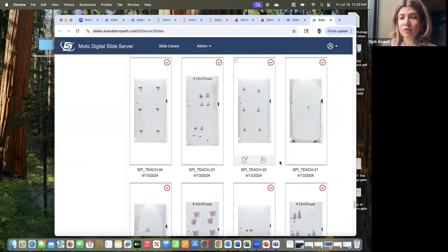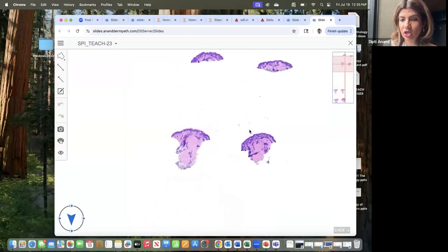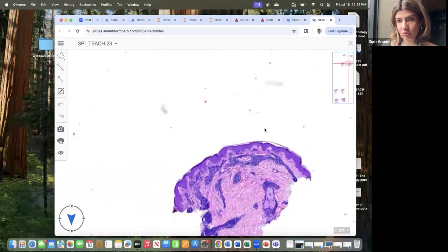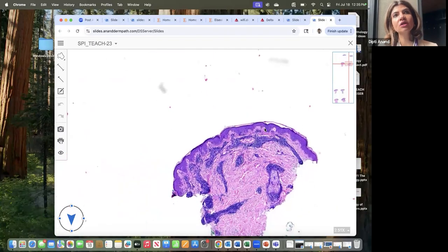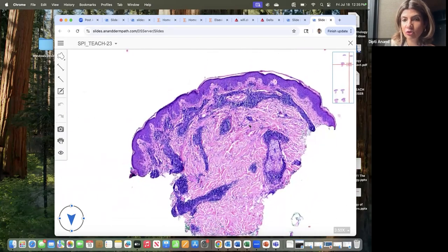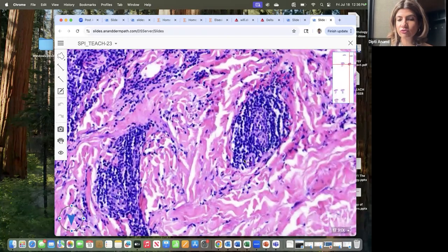The other thing is pernio and polymorphous light eruption will both look the same. Pernio is the cold phenomenon, PMLE is the hot phenomenon. Polymorphous light eruption will look like pernio, plus because it is light, it can also look like other things. But this is how you approach this biopsy. For example, you again are having a superficial and deep lymphocytic infiltrate, right? So you can go up on high power and look for the presence or the absence of eosinophils.